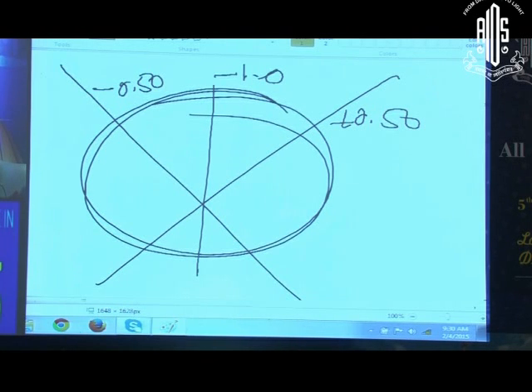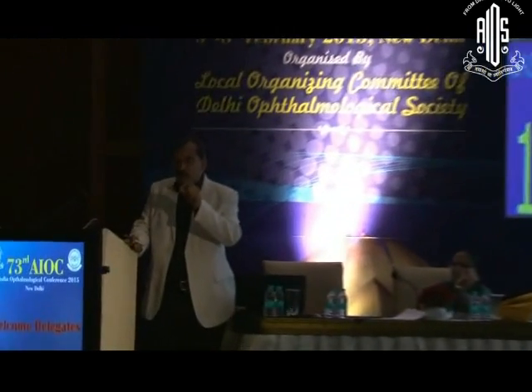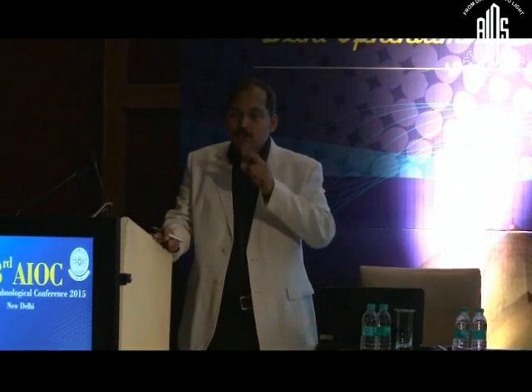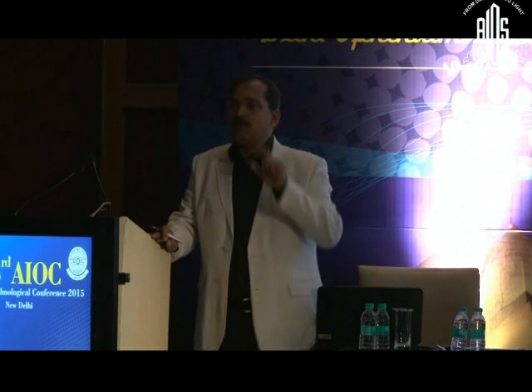You straddle it like this and see whether the patient reports improvement in the vision. The patient should not be 6/6. What you do is, imagine he has minus 2 sphere correction. You change the sphere correction to minus 1.5. See that vision is 6/12.